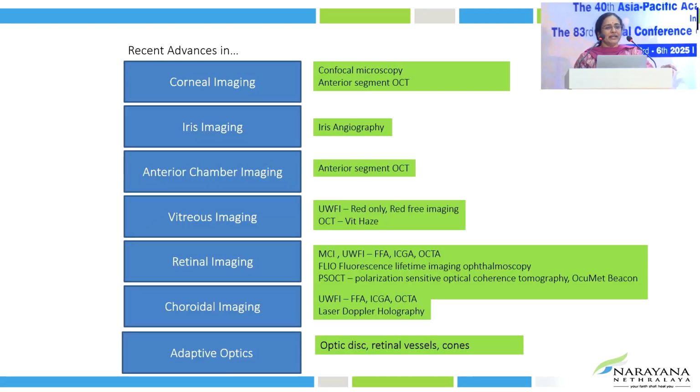Moving on to the retina, we have multicolor imaging and ultra-wide field imaging, which includes fundus photography, fundus fluorescein angiography, indocyanine green angiography, and OCTA. So all can be done with ultra-wide field. The next is FLIO, an upcoming one, that is fluorescence lifetime imaging ophthalmoscopy.